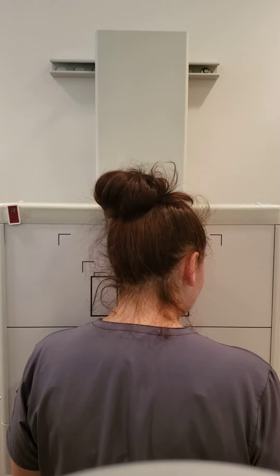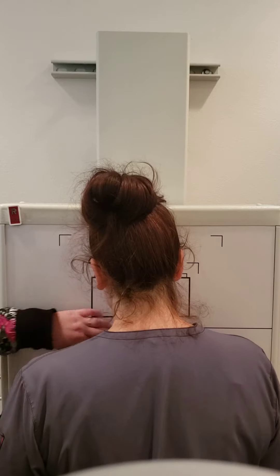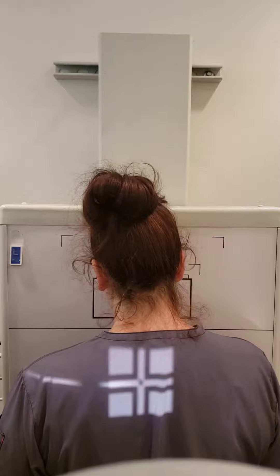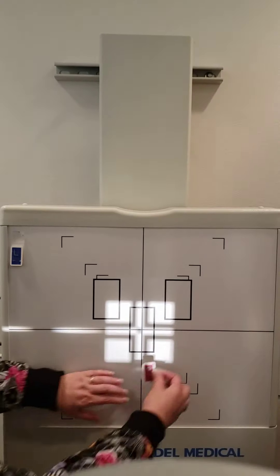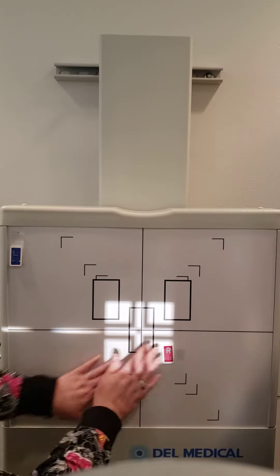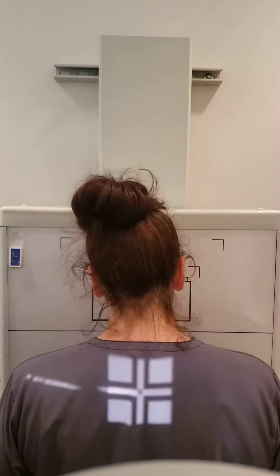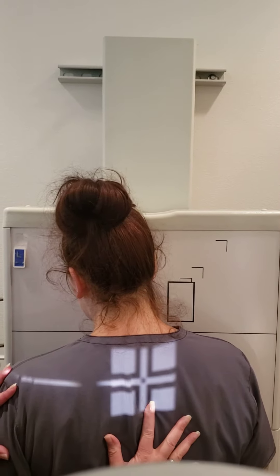Now we're going to rotate the patient into a 15 to 20 degree RAO. I'm going to change my marker. We'll get you to step aside and place our marker in the right lower corner. Right back up — so you're facing the board and we're going to have her in a RAO. Here's her spine.